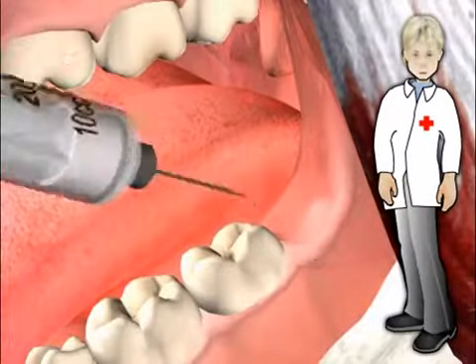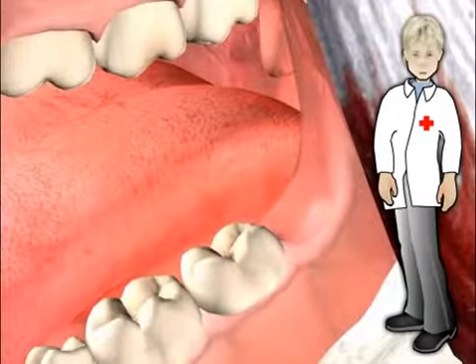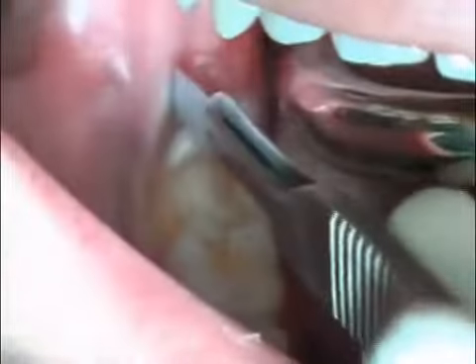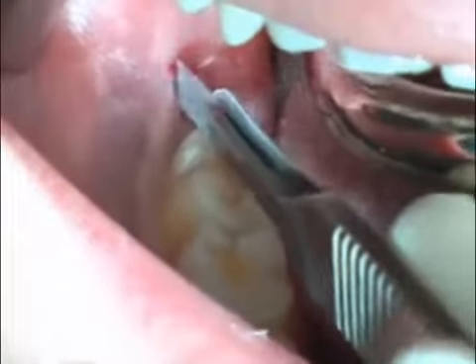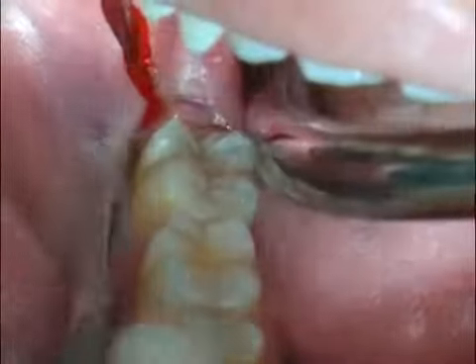In the following video, a minor opening is performed because the wisdom tooth is in an easily accessible position. If you'd prefer not to see any blood, return to the beginning and click on Animation. First, the surgeon obtains an overview. He palpates the ascending branch of the lower jaw and properly places the Langenbeck. Then he makes the cut.